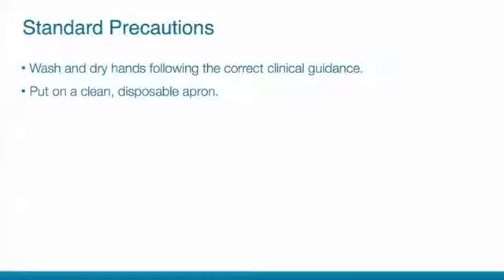It is important to thoroughly wash and dry hands following the correct clinical guidance.